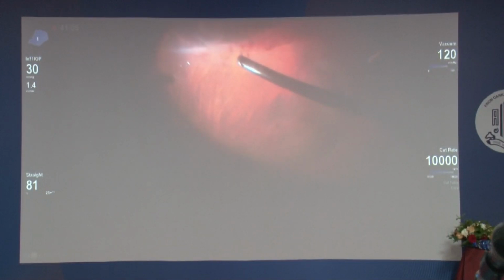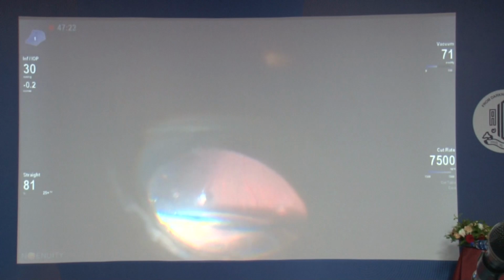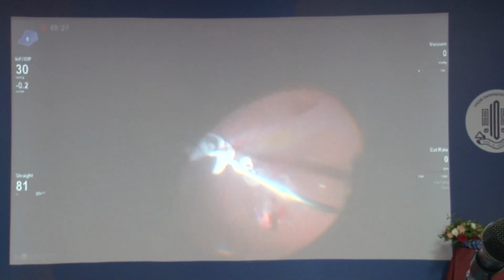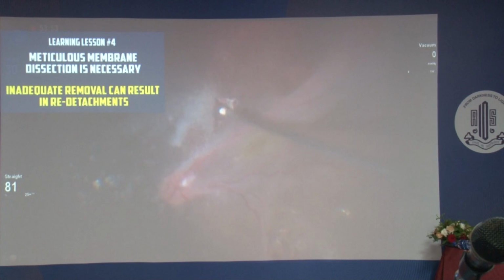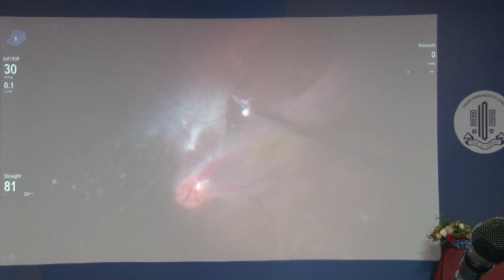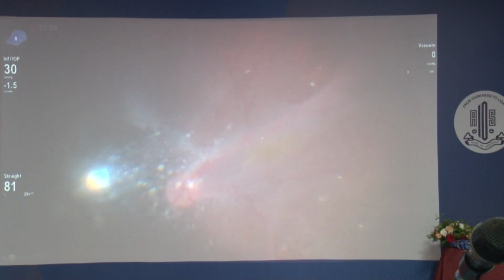Peripheral vitreous-based shaving was initiated before tackling the retinal fold and the inferotemporal angioma. Triamcinolone was used to stain the vitreous membranes so that the retinal fold could be dissected. An important lesson is that eyes with hemangiomas commonly develop epiretinal proliferation, which needs meticulous dissection. Tano's diamond dusted scraper and internal limiting membrane forceps were used to remove these membranes to relieve all the traction.